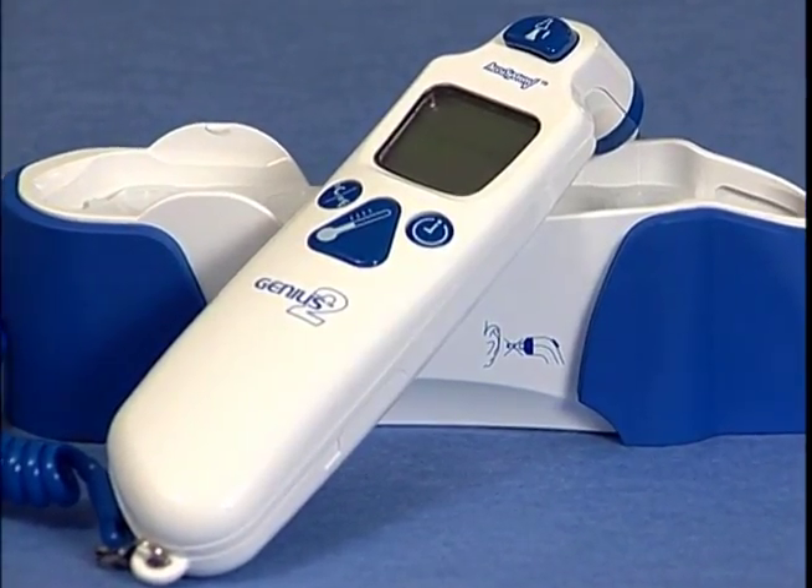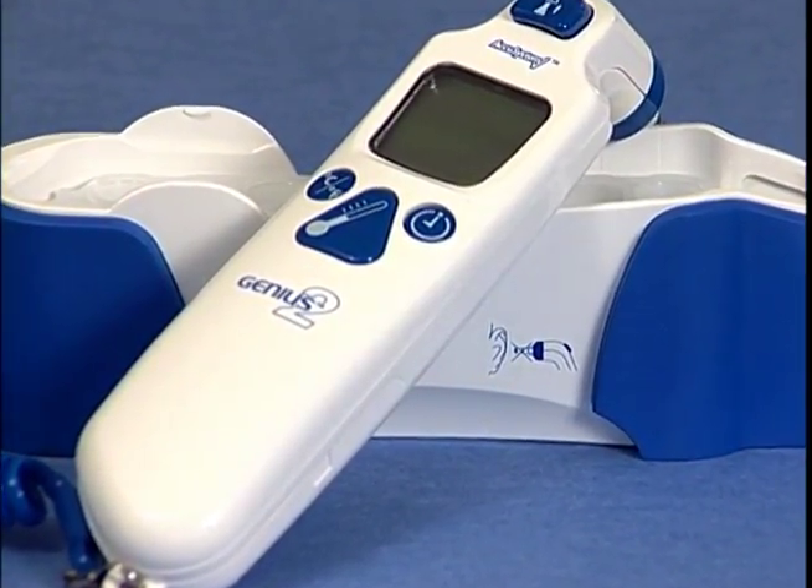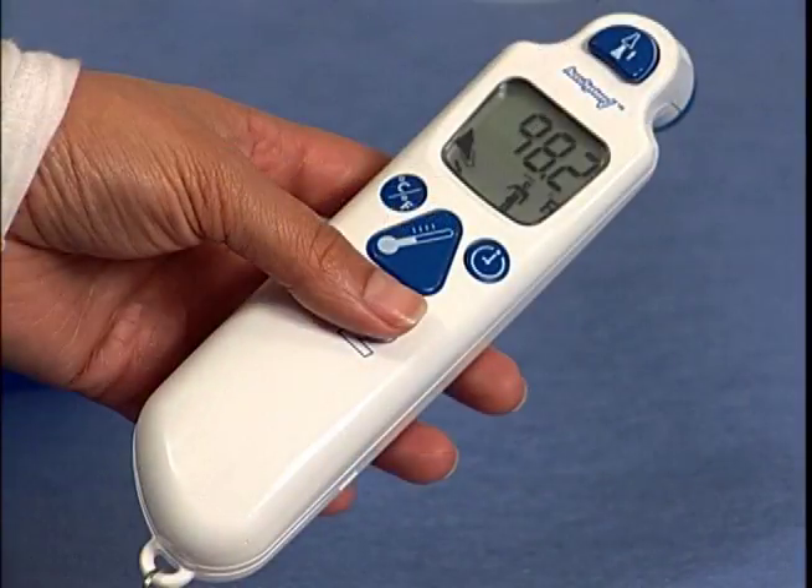The Genius 2 is designed for ease of use. The simple design includes four basic control buttons. The eject button releases used probe covers from the unit. The scan button activates the Genius 2 for quick temperature readings.